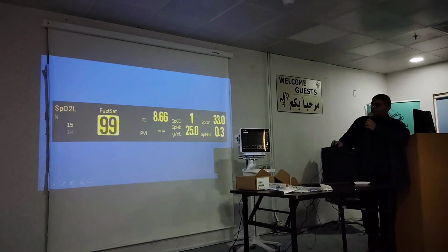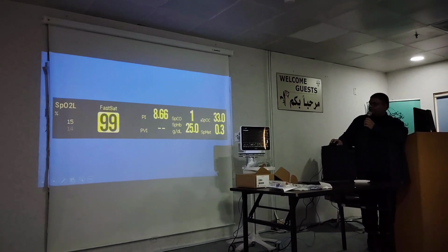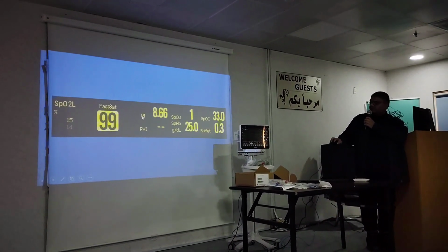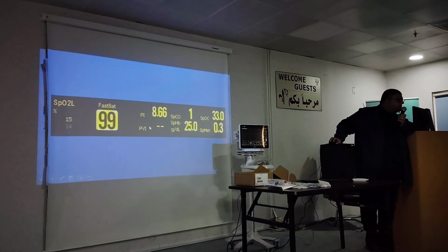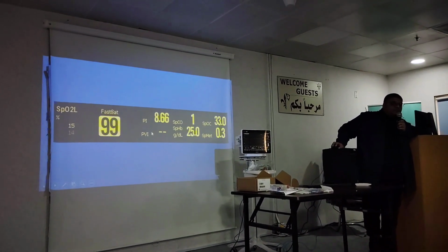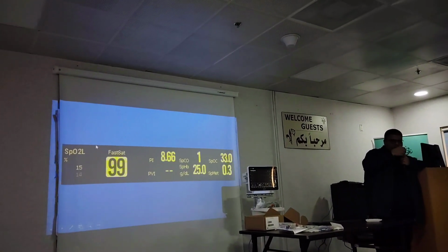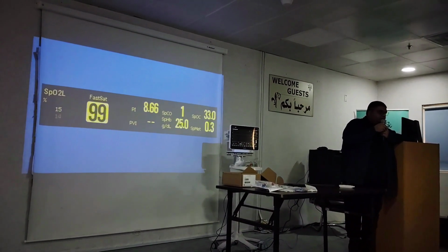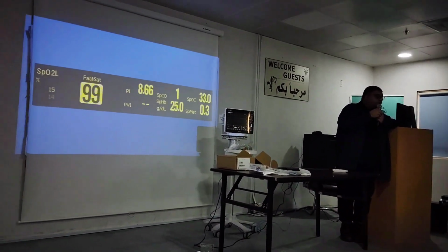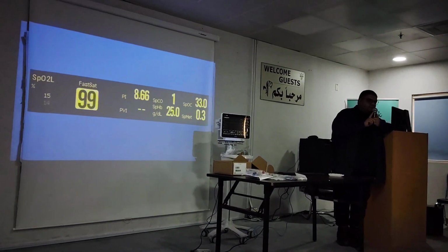So here, this one is the SpO2 value, of course. Then we have these parameters you can see here. This is a common one, perfusion index. We know what it is. Everyone knows what that is, right? Perfusion index shows you if there is enough perfusion to the tissue. So for example, you're using SpO2, but suddenly the perfusion decreases below 1, maybe even below 0.3. Okay, that means there is not enough perfusion to the finger.